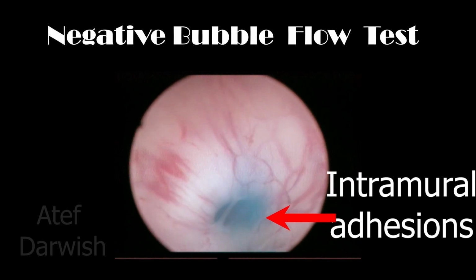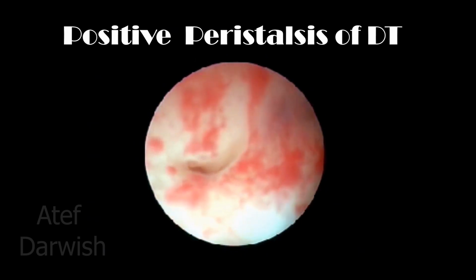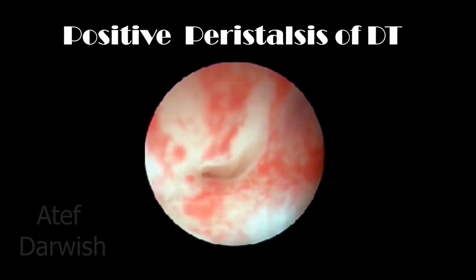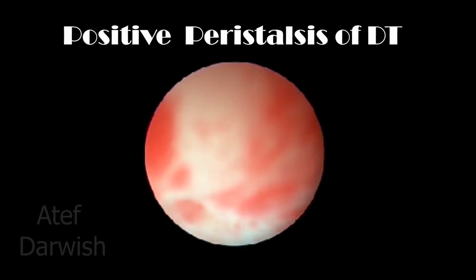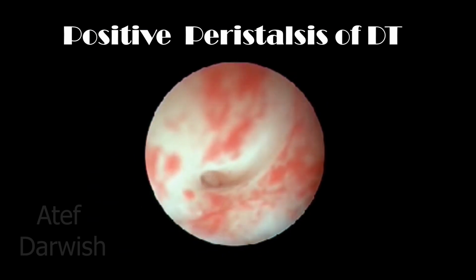In this case, you can see the tubal ostium and intramural part moving, contracting and retracting, with contractions and relaxation, and this is called peristalsis of the proximal part of the fallopian tube. So this is a positive peristalsis test of the proximal part of the fallopian tube.